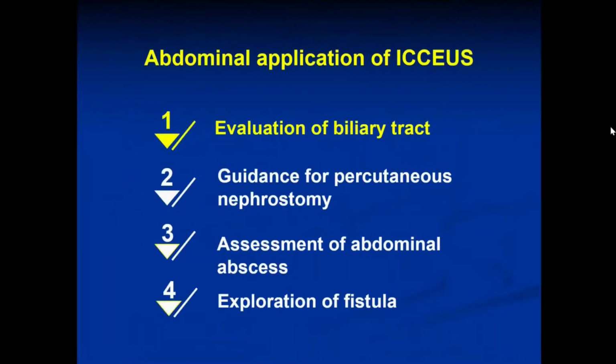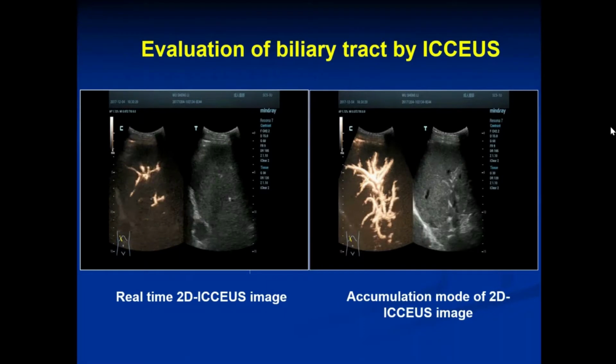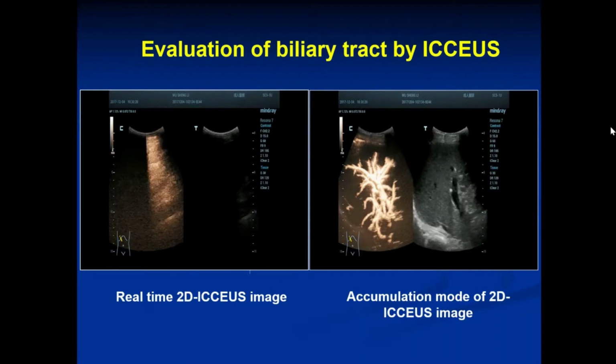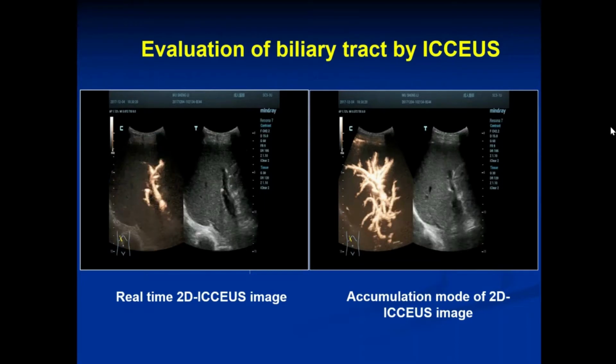There are many abdominal application aspects of ICCEUS. Today, I would like to introduce 4 main aspects, besides which introduced by Professor Law just before. The first one is evaluation of biliary tract. Real-time 2D ICCEUS and accumulation mode of 2D ICCEUS can be used to evaluate biliary tract.